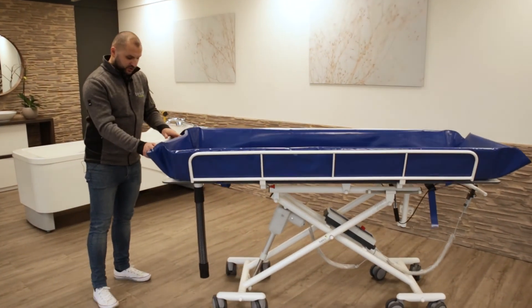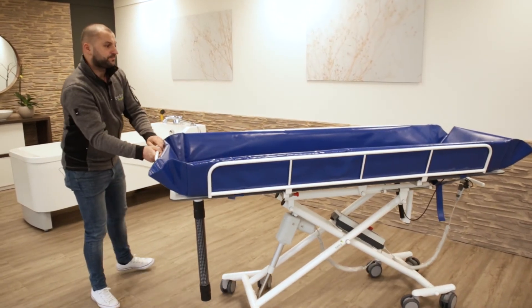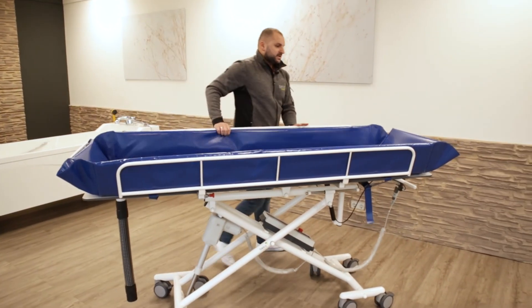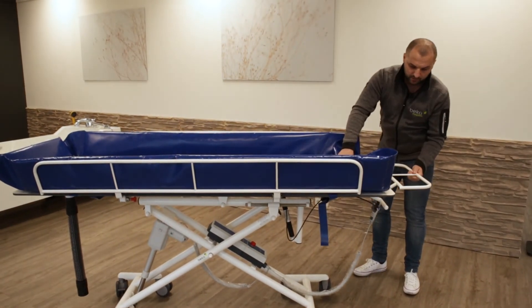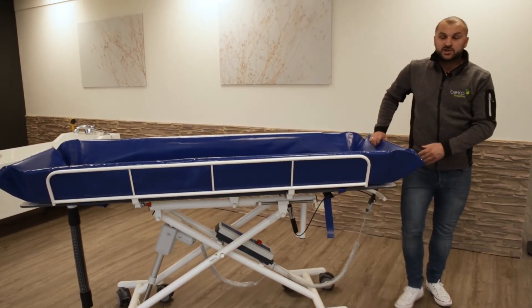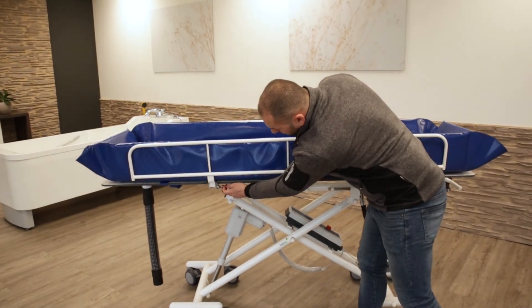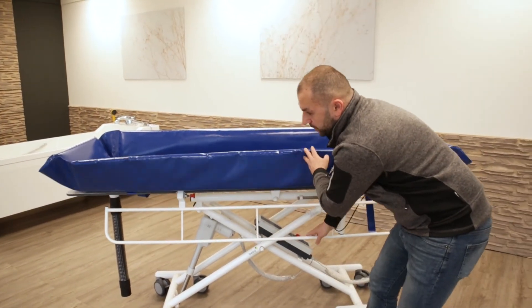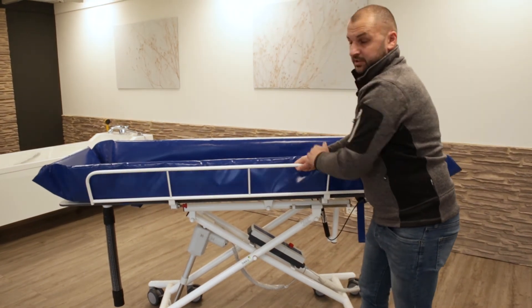On the feet side, make sure that the bolts are securely fixed and it is stable. On the head side, make sure that the head part is going down and going up and is secure. For the side rails, you have a security pin — the red one. By pulling it, you can make the side rail go down and back up — make sure it is secure.